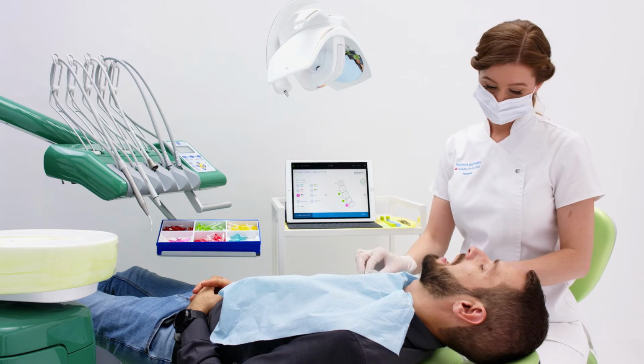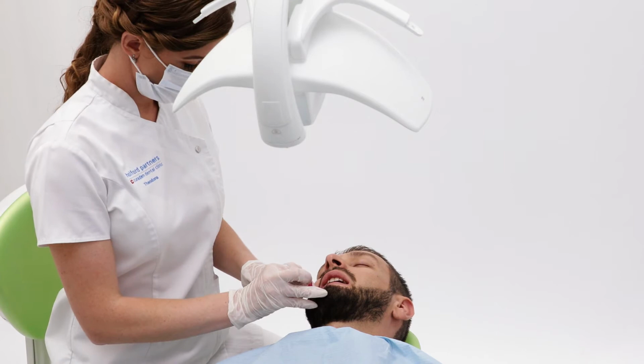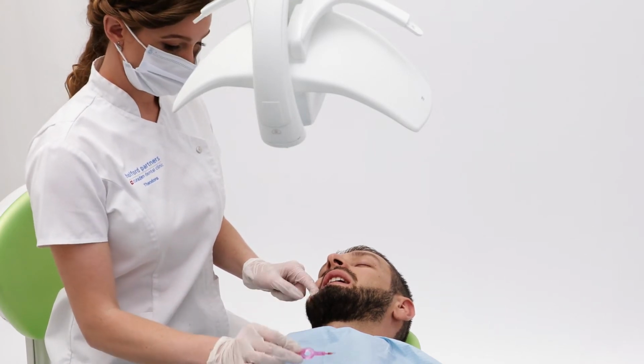I finish on the last sextant, that being the lower right, and it is now time to continue with the dental cleaning.